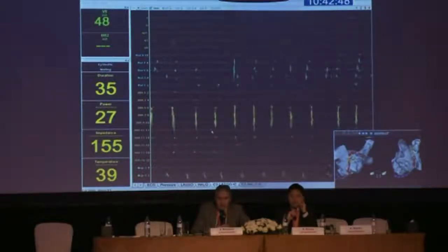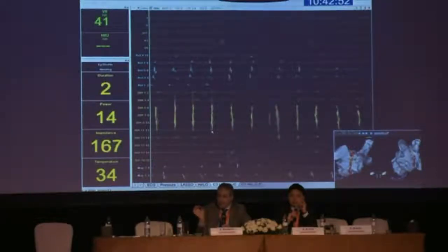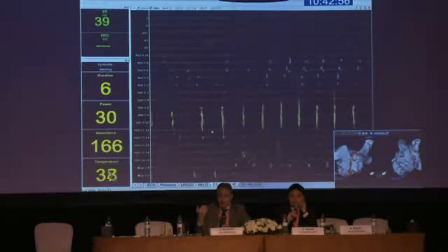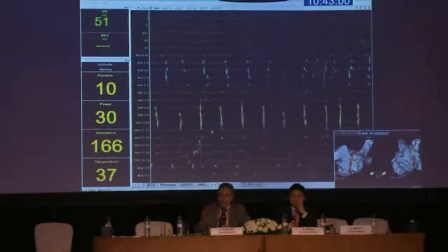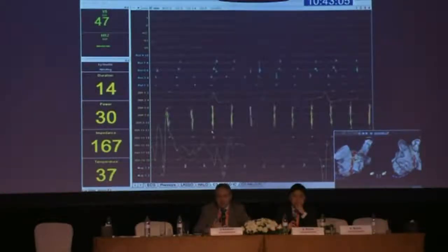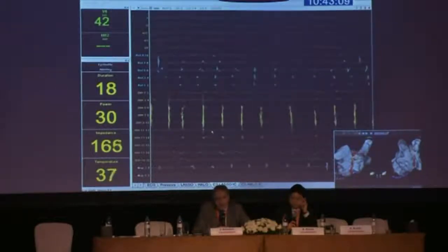That's also an advantage. Here you can hook the catheter in the ridge a few millimeters behind the ridge, and you can keep it there, which is very difficult sometimes with manual, or you slip out, so it takes some time to come back. Here you come back very easily without the need for using X-ray at all. So that's, in my opinion, one of the advantages.